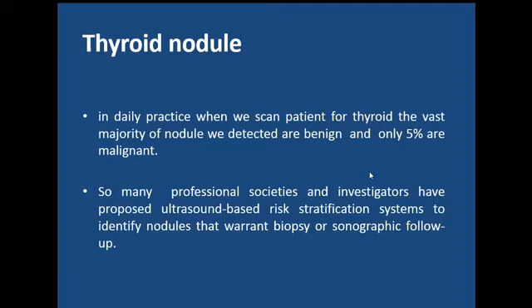So this led many investigators around the world to try to bring us a stratification system that helps us to determine which nodule needs FNA and which nodule needs follow up. And actually the idea came after they found the BI-RADS. Maybe most of us have tried the BI-RADS, especially the female sonographers. The BI-RADS is used to give a score for the breast lesion.